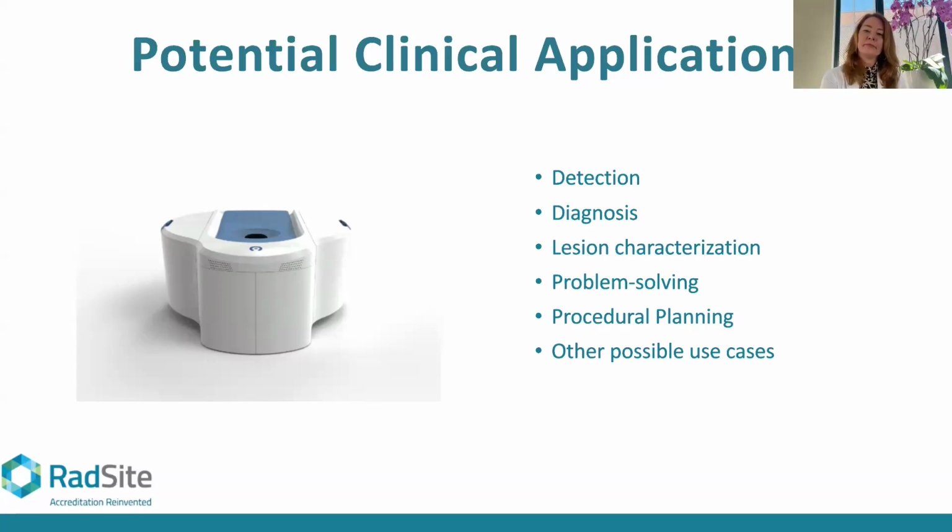And so we know for a fact we're not missing anything next to or even behind the implant. These are places that a mammogram is just not going to be able to interrogate at all. Wow, that's so many fascinating topics to discuss.